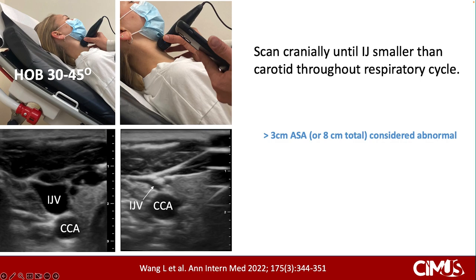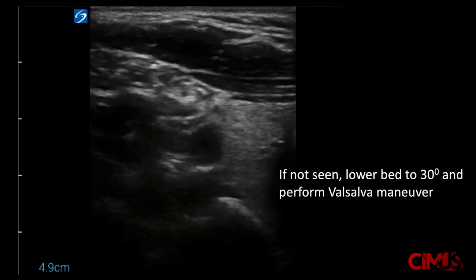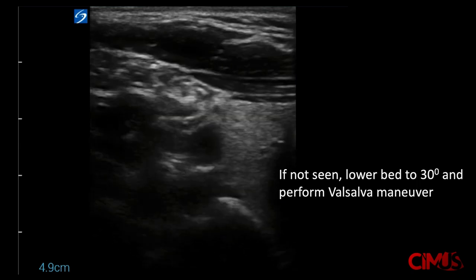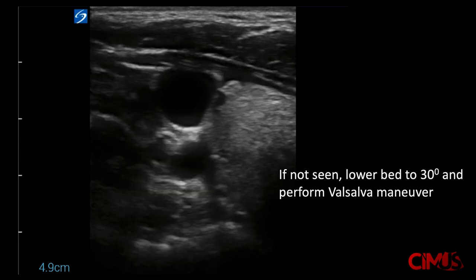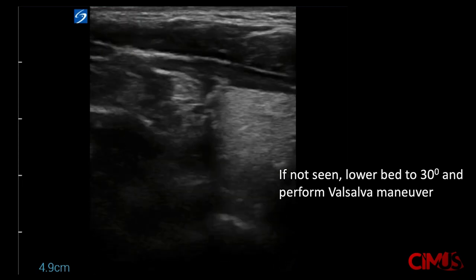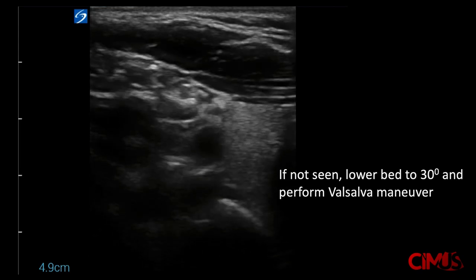Be sure that the transducer is parallel to the floor and not tilted, as shown in this picture. If the internal jugular vein is not seen on this initial exam, lower the bed to 30 degrees and have the patient perform a Valsalva maneuver to confirm its anatomical location. In these cases, it is considered 0 cm above the sternal angle, and therefore adding 5 cm results in a JVP of 5 cm of water pressure.